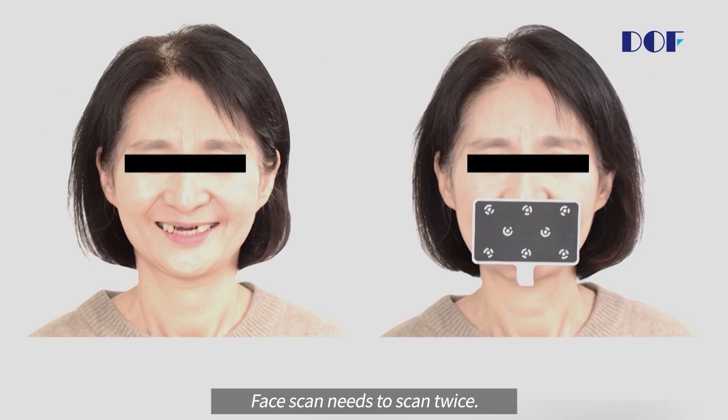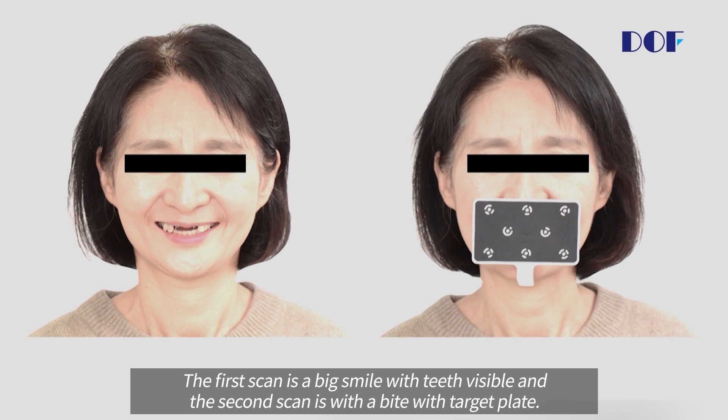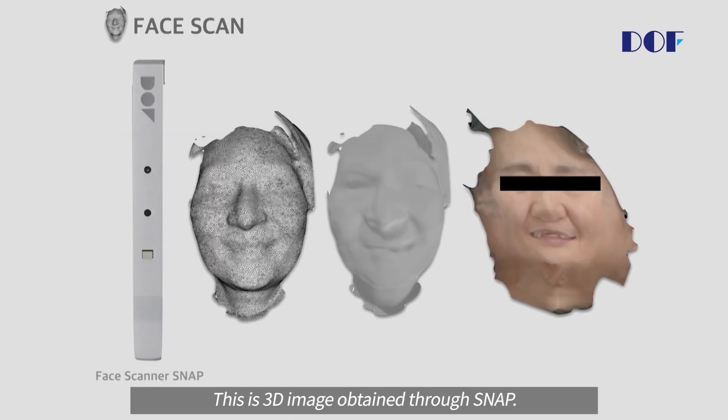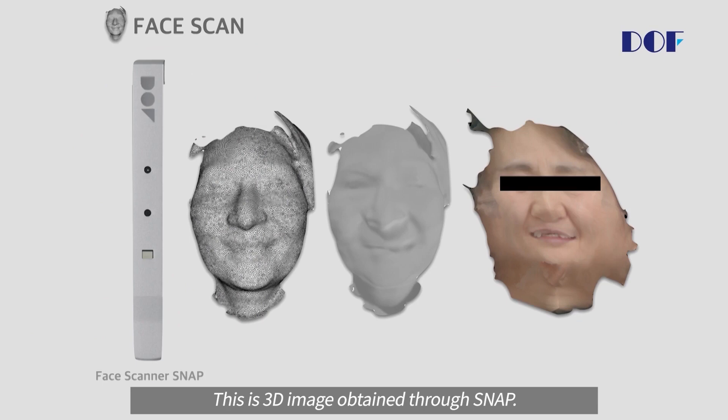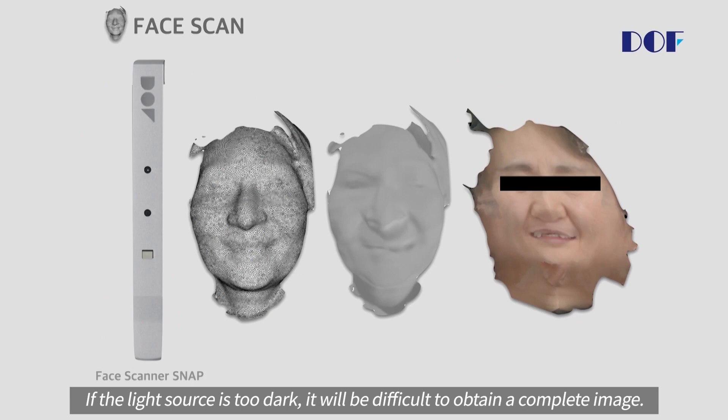The face scan needs to be done twice. The first scan is a big smile with teeth visible, and the second scan is with a bite with a target plate. This is a 3D image obtained through Snap. If the light source is too dark, it will be difficult to obtain a complete image, so it should be taken from a proper light source.